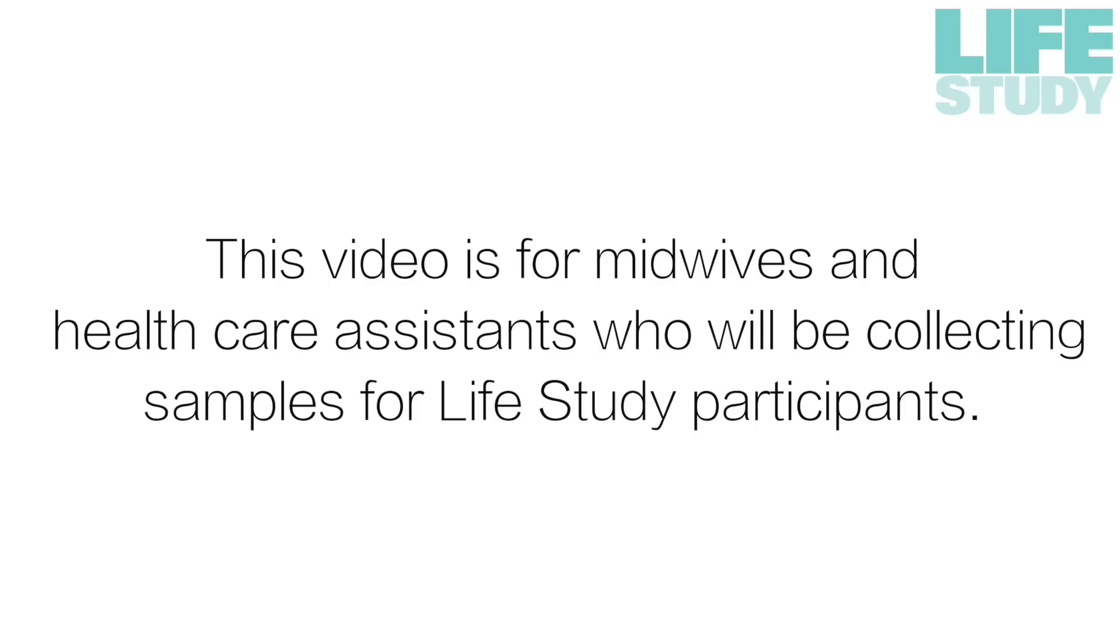This video is for midwives and healthcare assistants who will be collecting samples for Life Study participants. This video shows how to collect a vaginal swab.